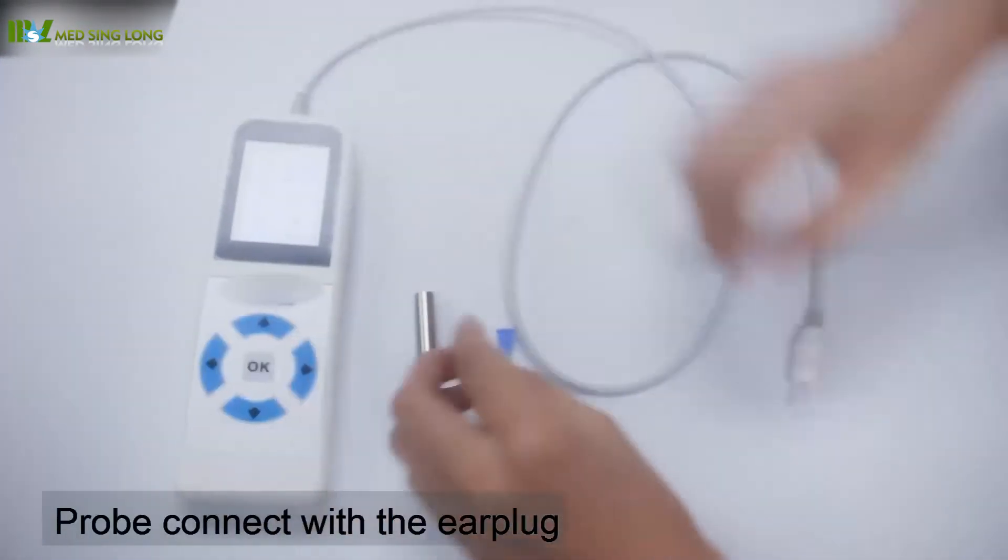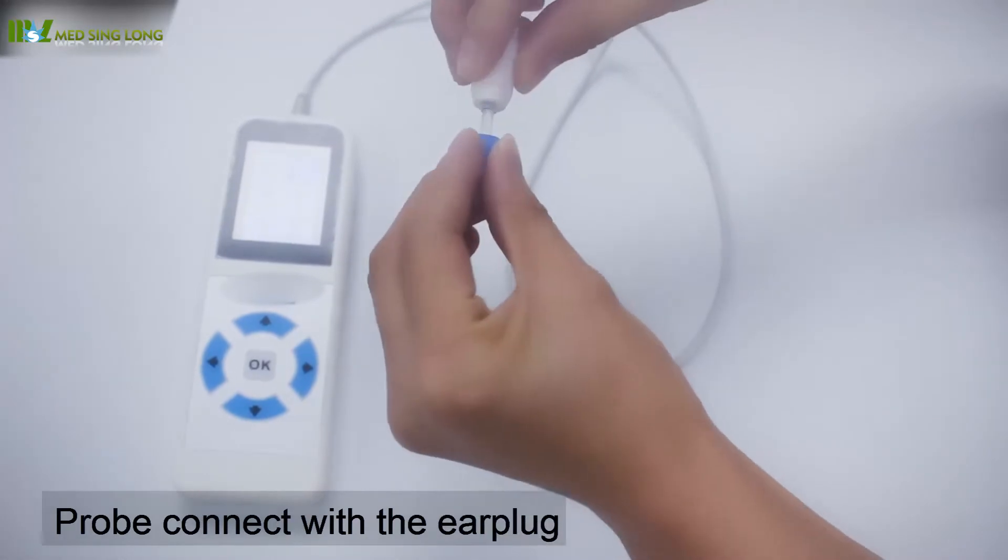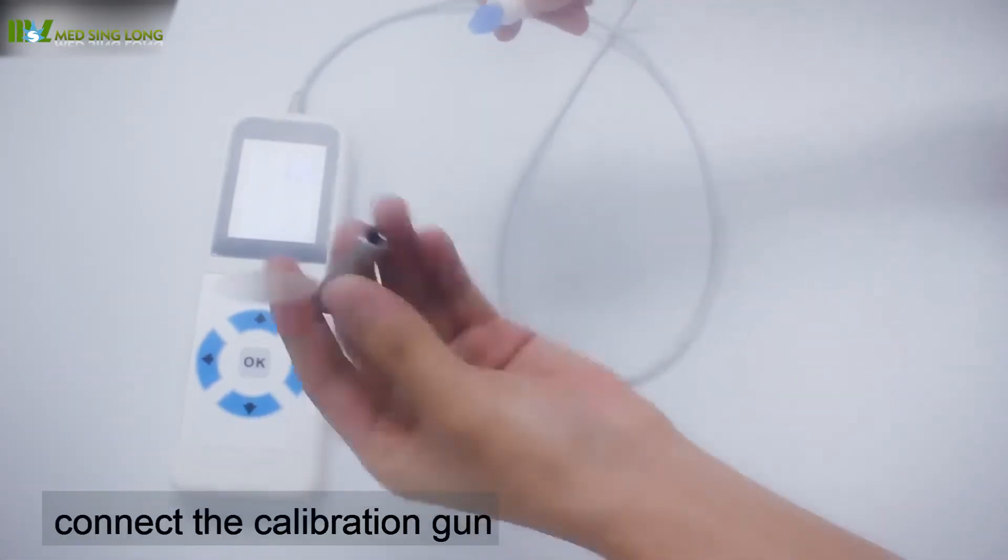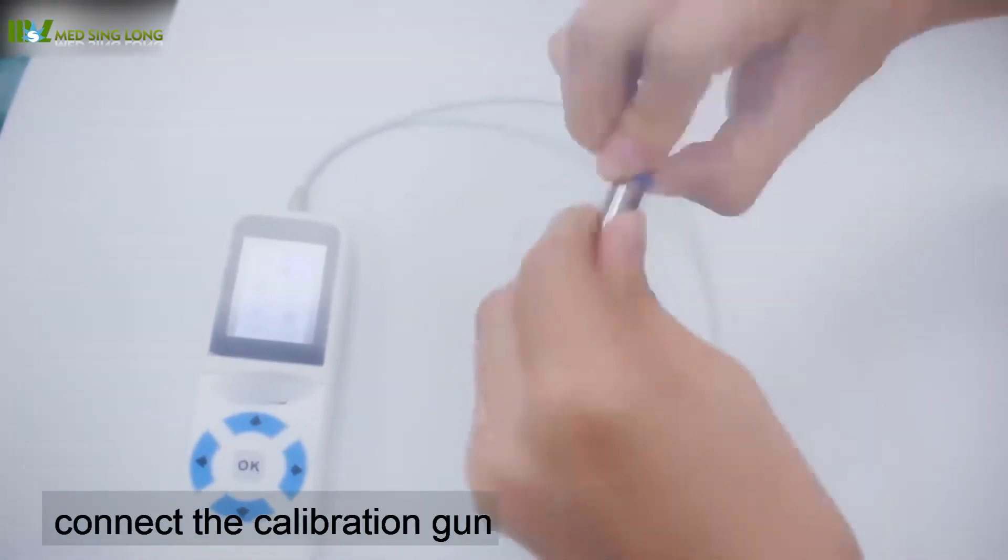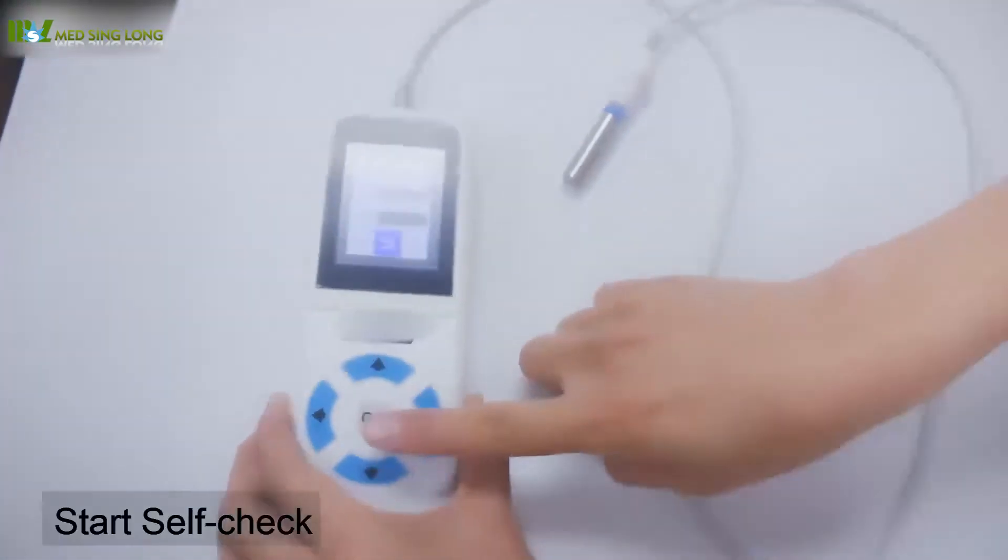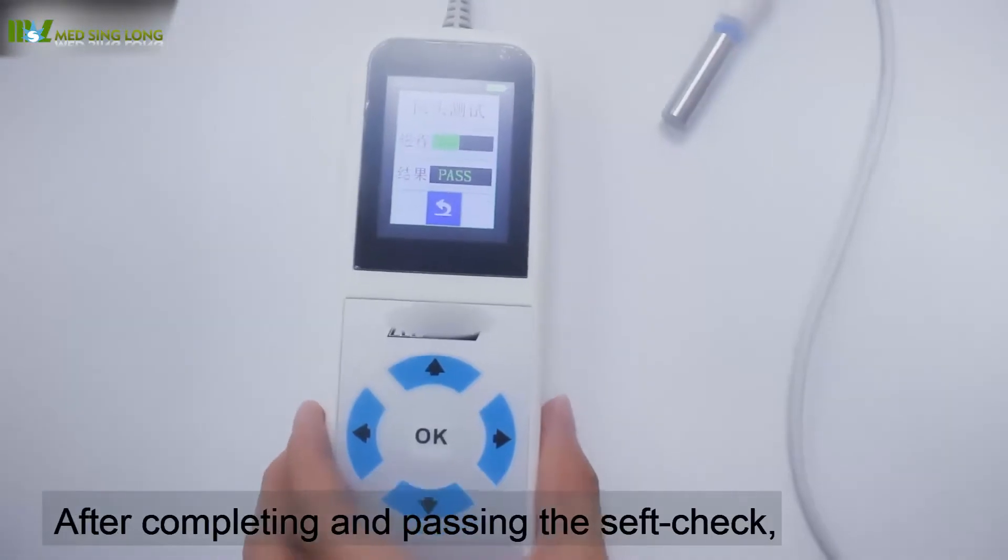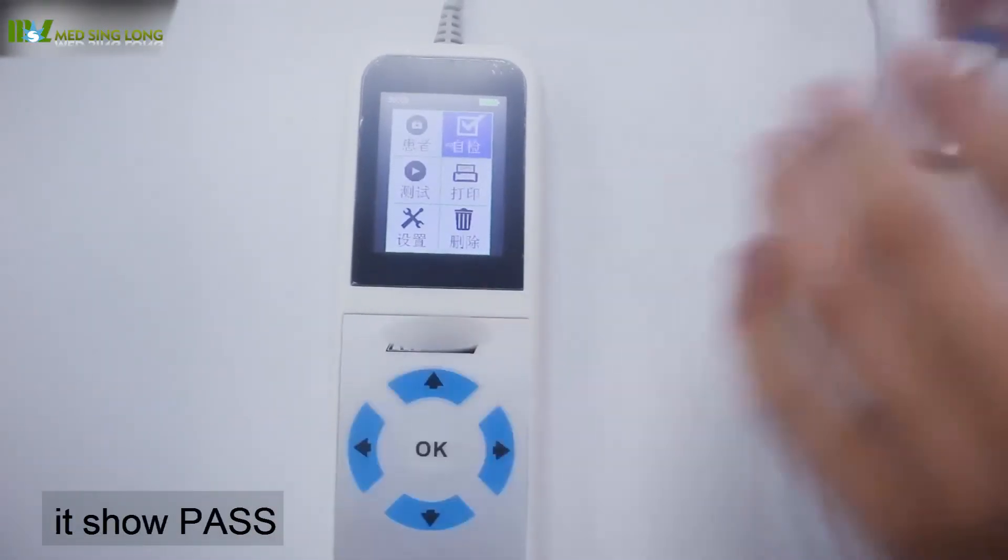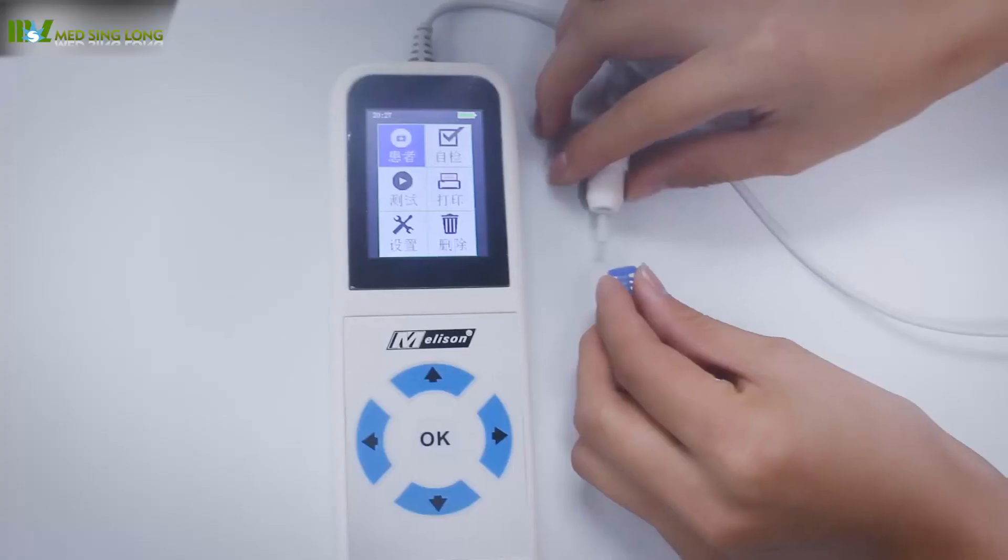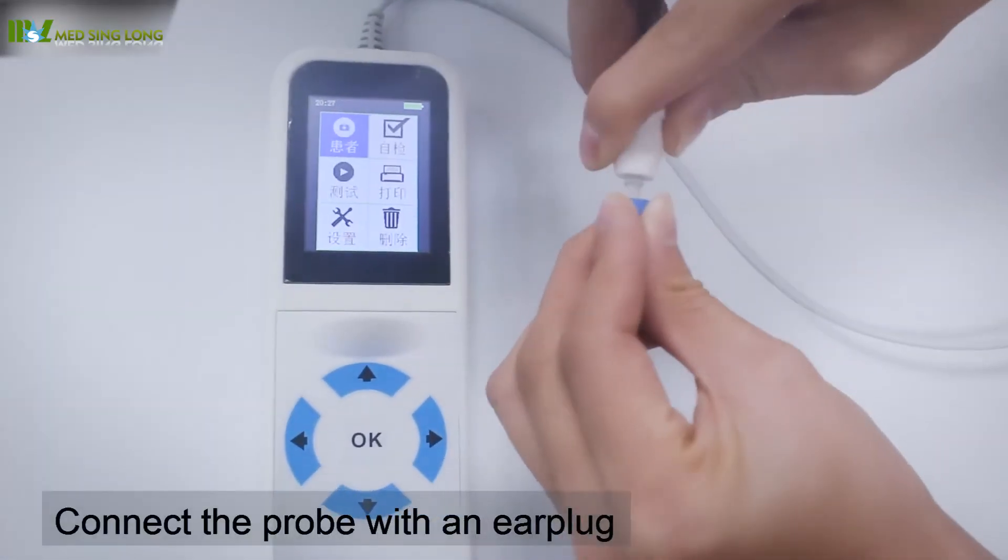Connect the probe with the ear plug, then connect the calibration gun. Start the self-check. After completing and passing the self-check, enter the tester number and connect the probe.